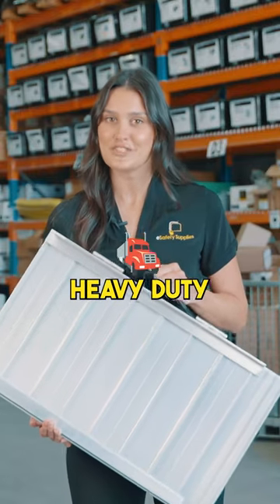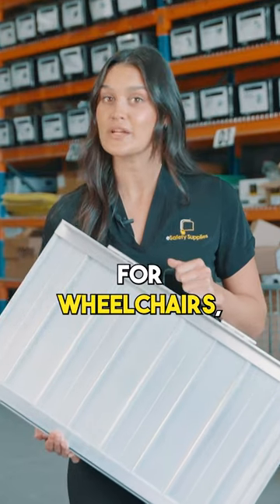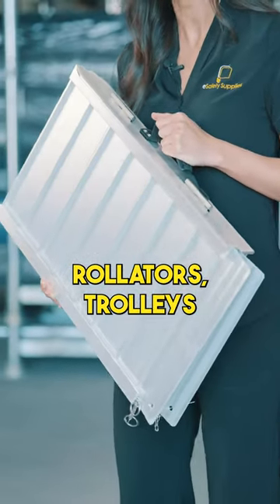Our versatile, heavy-duty rubber ramps are perfect for wheelchairs, scooters, rollators, trolleys, or pedestrians.